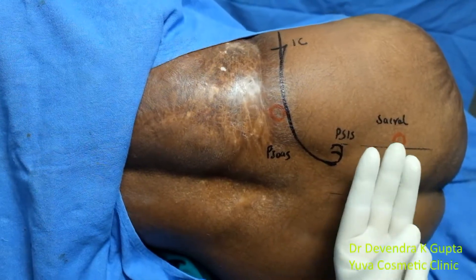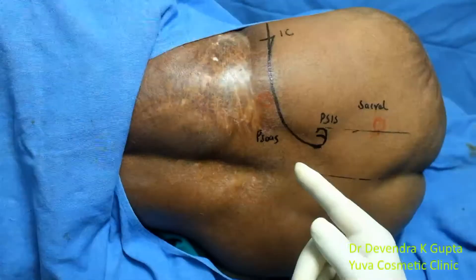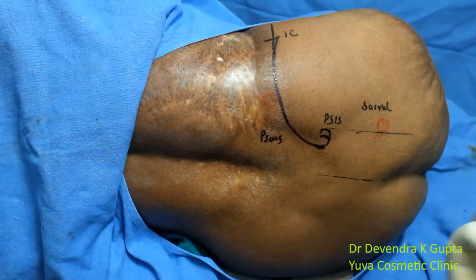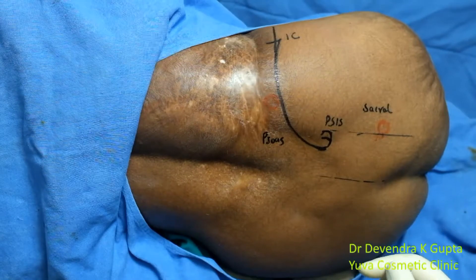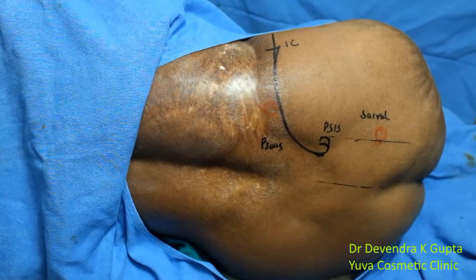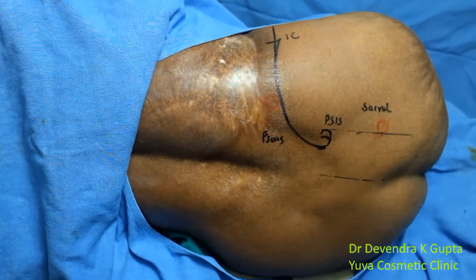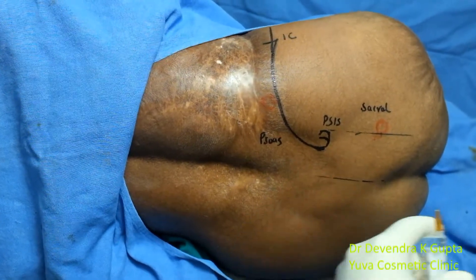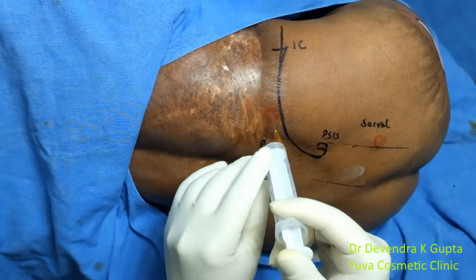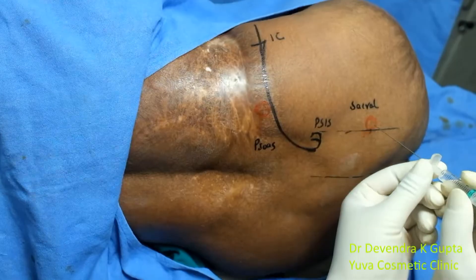These three finger widths are equal to the finger widths of the patient. If it is a pediatric patient, you take the widths of three fingers of the child. Now just anesthetize the entry point with a fine gauge needle — I have taken a 26 gauge needle — and insert the needle from the previously anesthetized point.